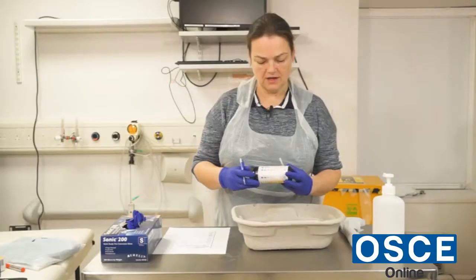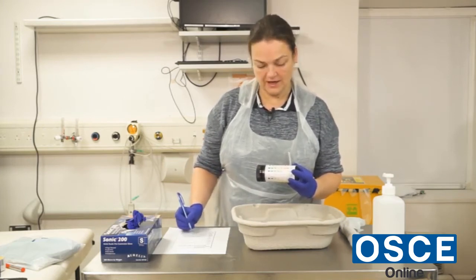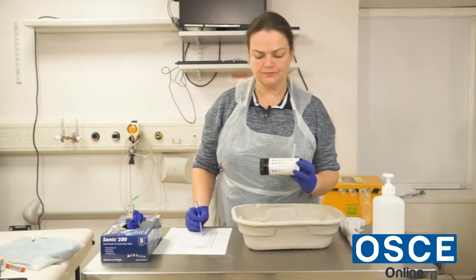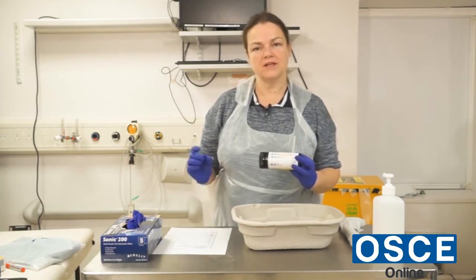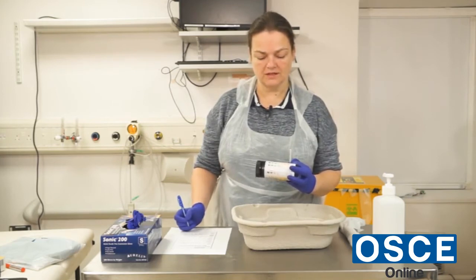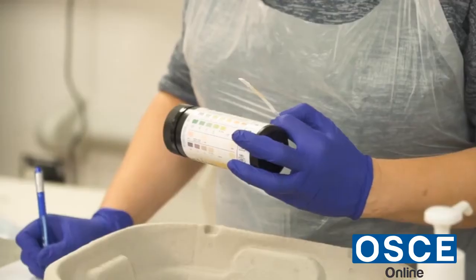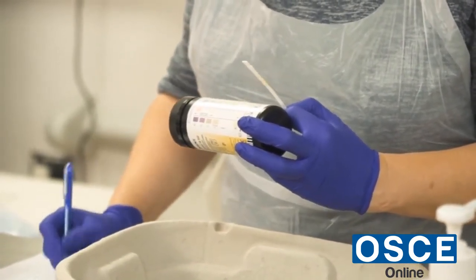60 seconds, and I've got to the blood part, and there's two parts to the blood sampling. There's hemolyzed and non-hemolyzed. So in the non-hemolyzed, it just shows dots of green. So this has dots of green, so it's non-hemolyzed. When it's a solid colour, it's hemolyzed. So this one's showing 2 pluses of non-hemolyzed blood. So I'm just going to put a tick in that box. And then pH is normal, it's 5.